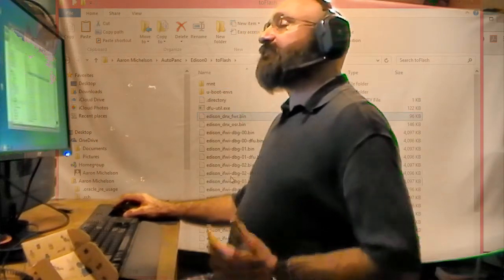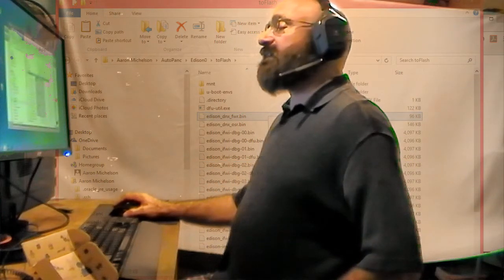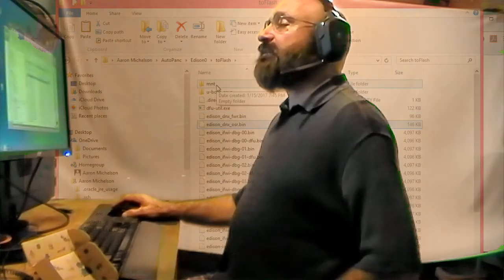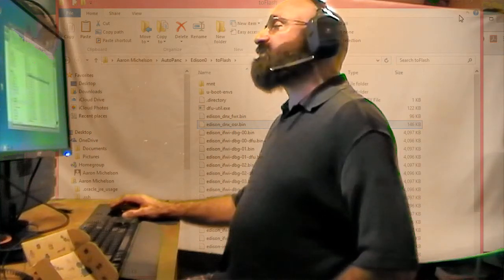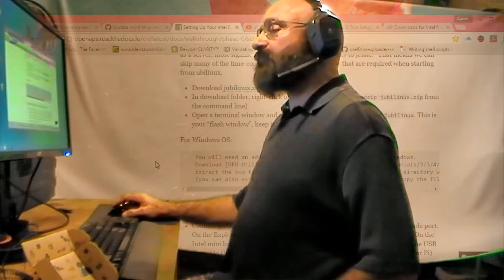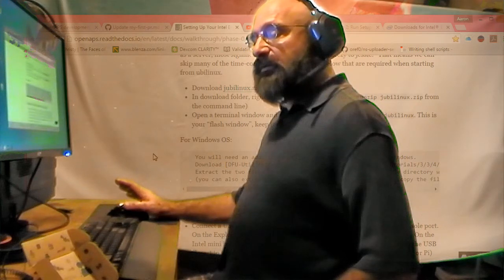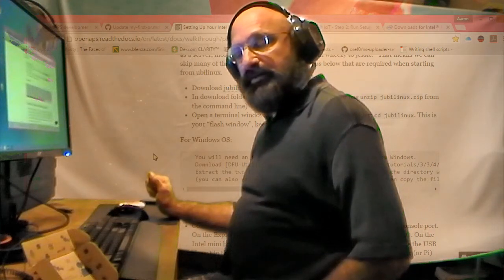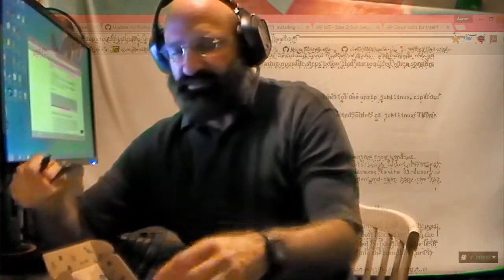and just be in this directory and go right click and paste, and that's all there is to it. Now we have all of the software that we need. So I'm going to close this file. At this point, we're going to have to plug in our computer. Okay, I'm plugging in USB ports.